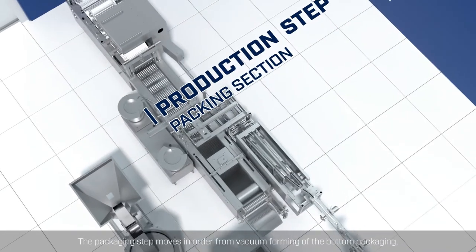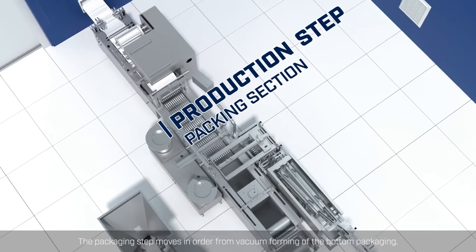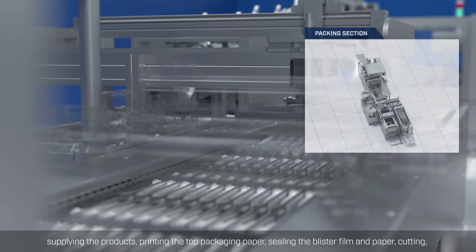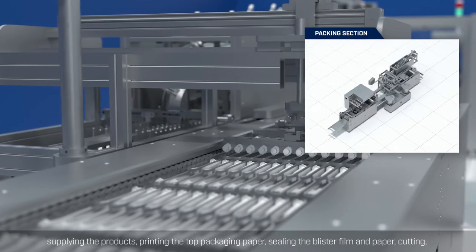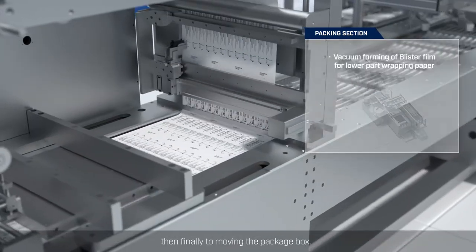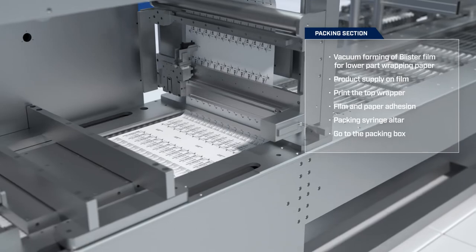The packaging step moves in order from vacuum forming of the bottom packaging, supplying the products, printing the top packaging paper, sealing the blister film and paper, cutting, then finally to moving the package box.